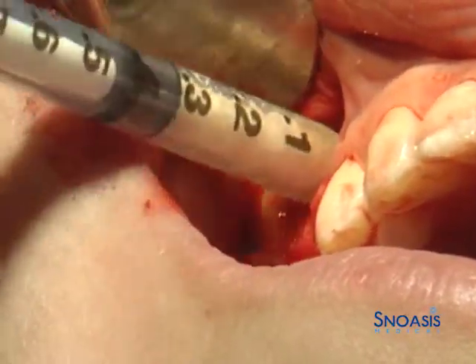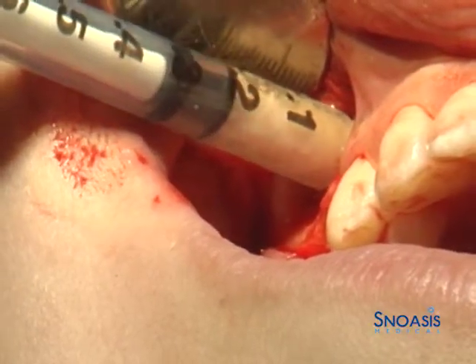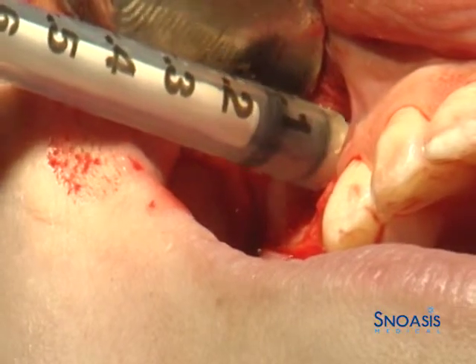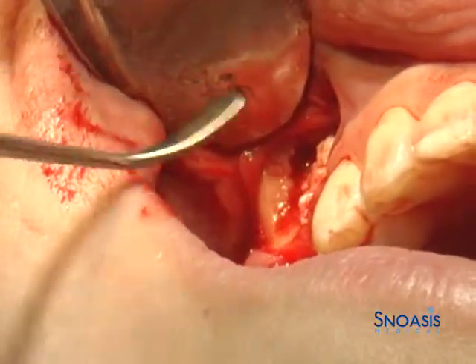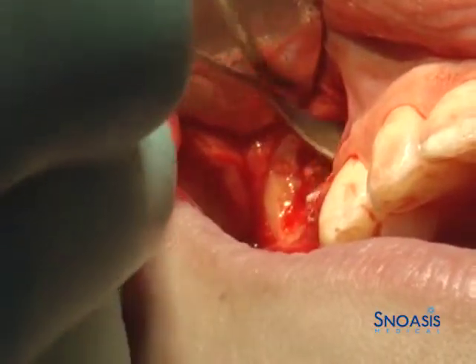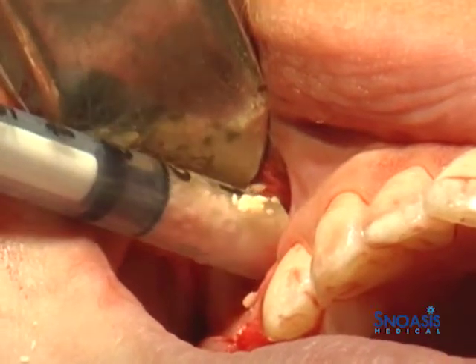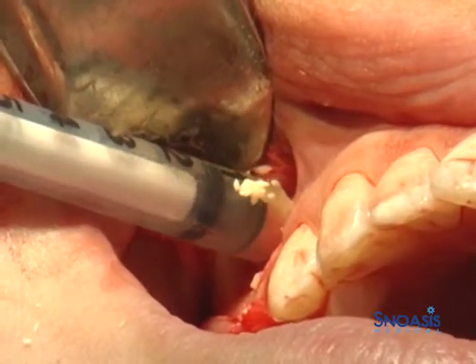At this time, a combination of xenograft bovine bone and allograft human freeze-dried bone is placed via a syringe into the sinus cavity and compressed towards the medial aspect. This is done prior to placement of the implant and final placement of particulate graft material.